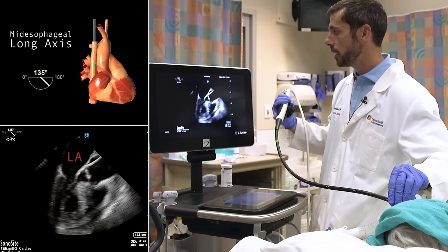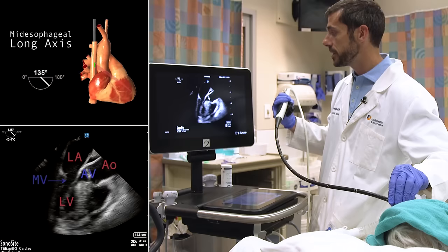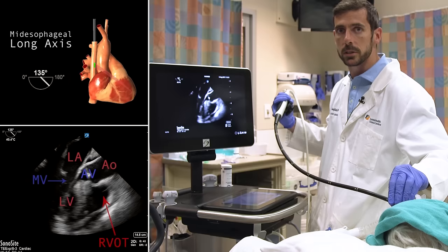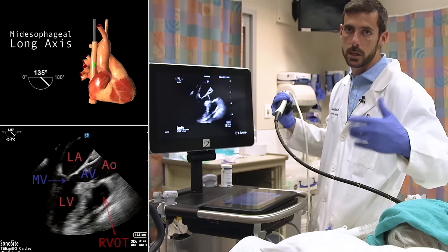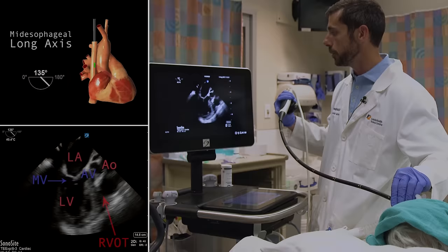Here we can see the structures of interest: the left atrium, left ventricle, aortic valve, ascending aorta, mitral valve, the RVOT on screen right, and the pericardium with that small pericardial effusion seen earlier. For those familiar with transthoracic imaging, this is basically a mirror image of the parasternal long axis view and its structures, so any interpretation skills from that view transfer easily here.